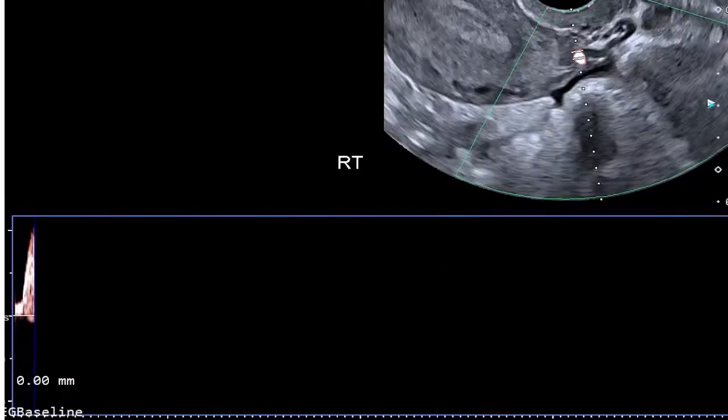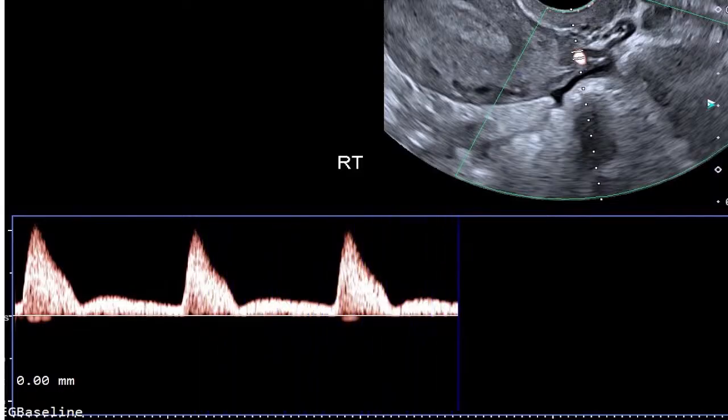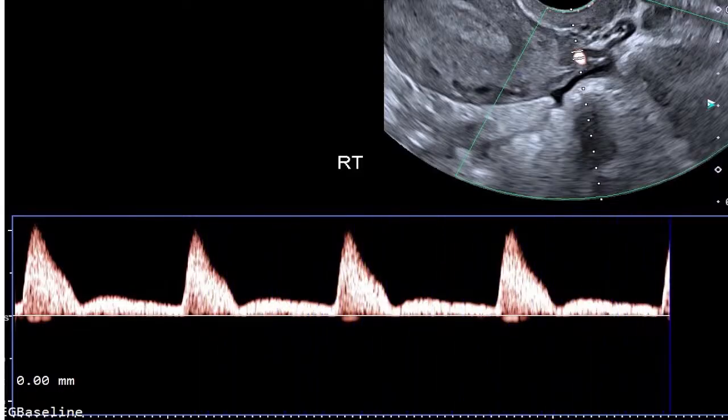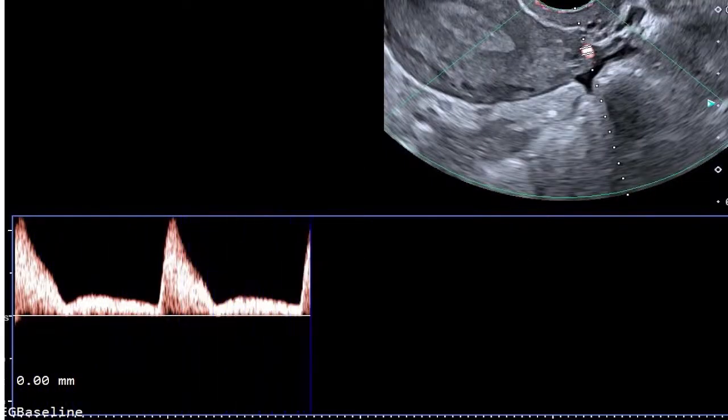Most people are not aware of how that is done. So I'm going to divide this into two sections, the practical aspect and then the theory aspect.